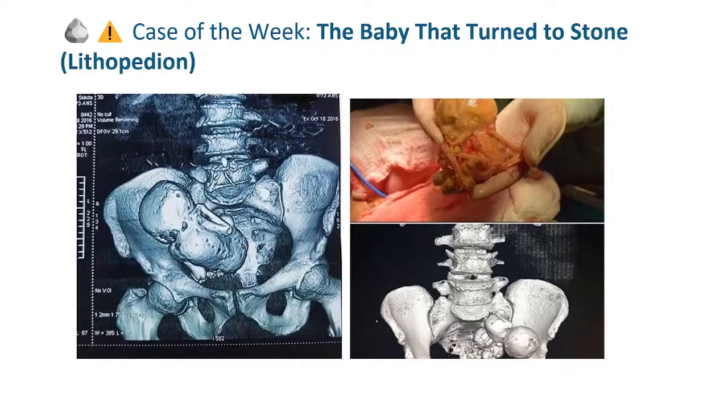At first glance, this patient simply presented with chronic abdominal discomfort and a pelvic mass. However, as the ultrasound probe was placed on the abdomen, an astonishing picture began to emerge.